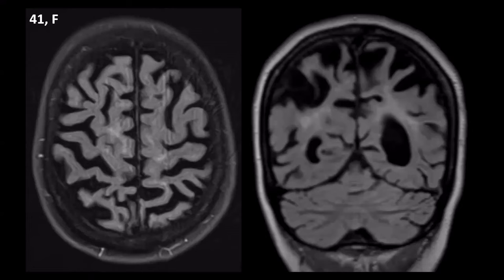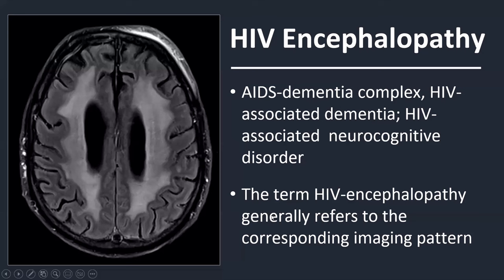Here is another example where the atrophy is more pronounced — a 41-year-old female patient with HIV. We have severe atrophy and some confluent periventricular white matter changes, but here the atrophy dominates the image more than the white matter abnormalities. Notice that the atrophy is located supratentorially and the cerebellum is relatively spared — there is some mild accentuation of the cerebellar fissures, but not much. So it's mainly a supratentorial atrophy.